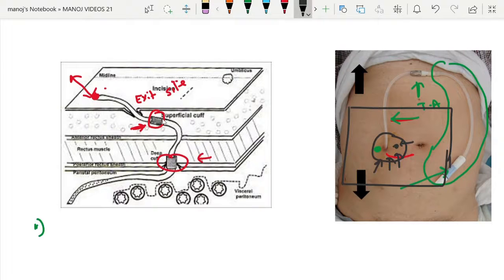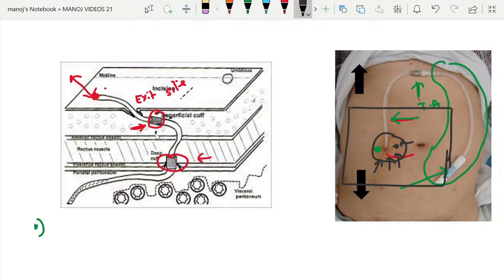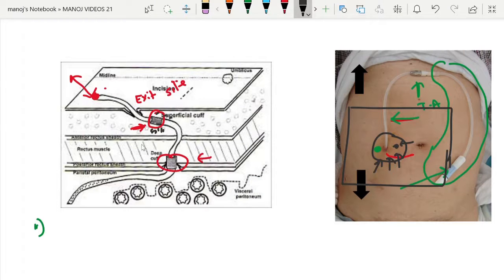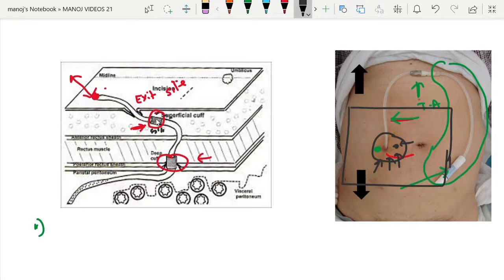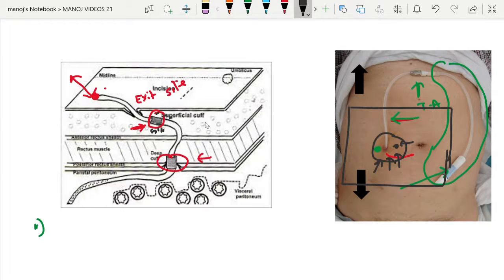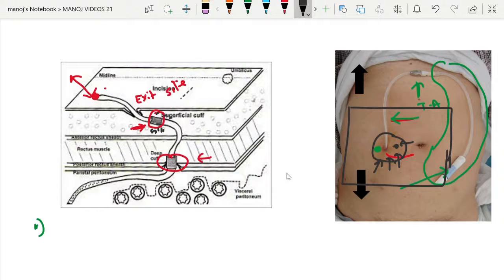Cut out the cuff from these adhesions. Suppose a patient is having this for more than two or three months, the adhesions will be more. The adhesions have to be dissected. Once the adhesions are dissected, just we have to rotate the cuff and pull it.